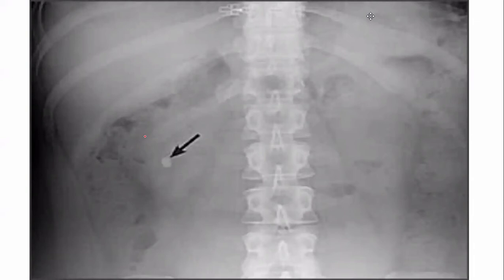For example, if you do an ultrasound and you happen to see a water density, like the urine itself, the shadow that is cast there is white. That's what you call posterior acoustic enhancement. And if, for example, you have a stone, the shadow that is cast there is black. That's why you call it posterior acoustic shadowing. It has something to do with it, therefore add it to your reading for tonight.